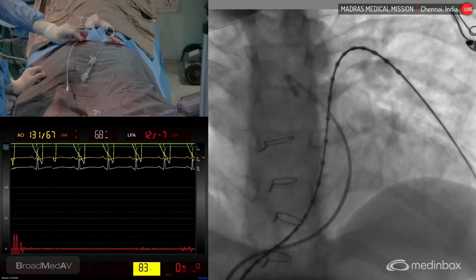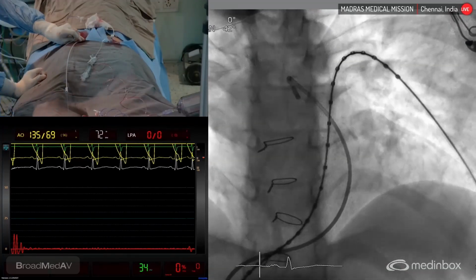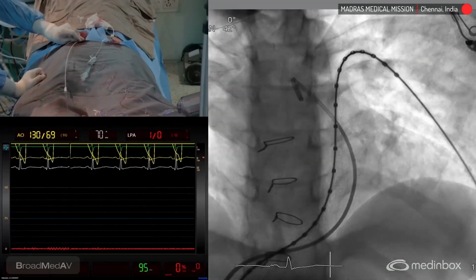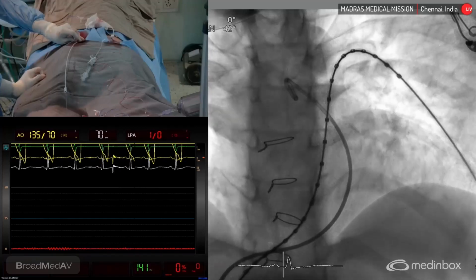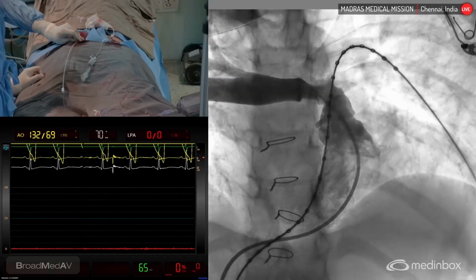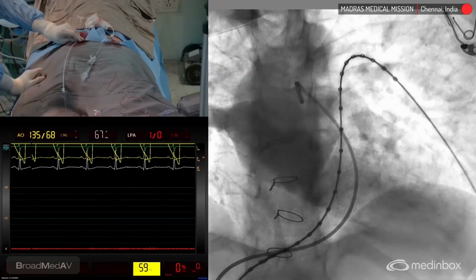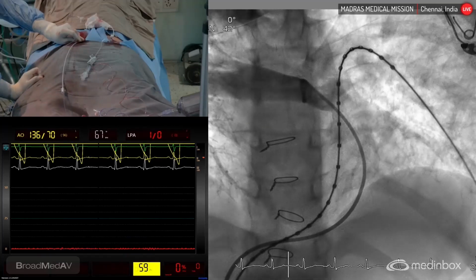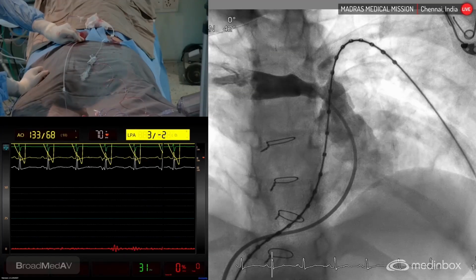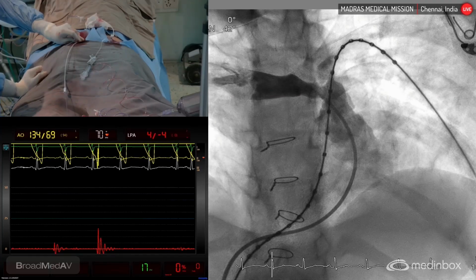So we are making one angiogram. Come a little towards me. We are going to make an angiogram with 25 ml of contrast at 15 ml per second across this outflow tract. Let's freeze it now. Go back. Yep, that's it. Next picture.